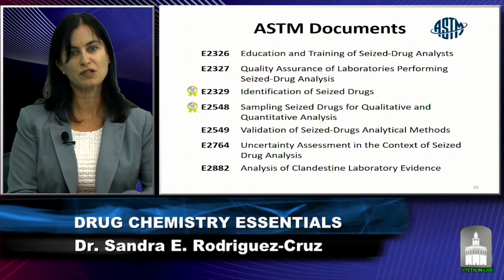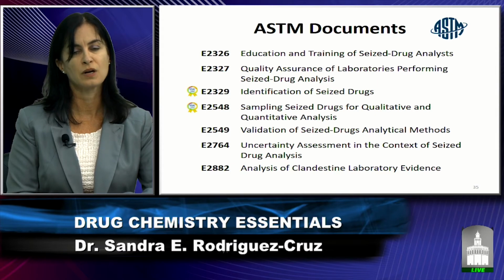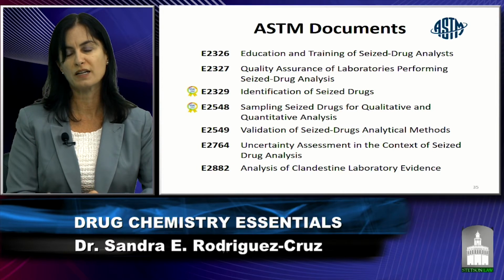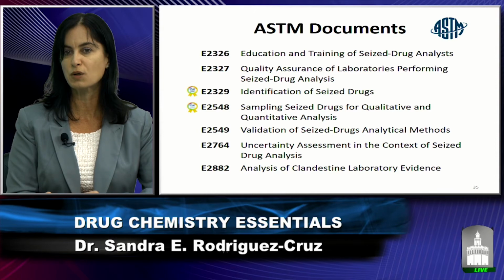A lot of these recommendations have been converted into standard development organization documents, and these are some of the documents that can be found through ASTM International. Two of these documents are marked because they are also documents that have been taken through the Organization of Scientific Area Committees and are now populating what we know as the OSAC registry, and they're available again to the public, and they pertain to the identification of seized drugs, those minimum requirements, as well as the sampling of seized drugs for qualitative and quantitative analysis.